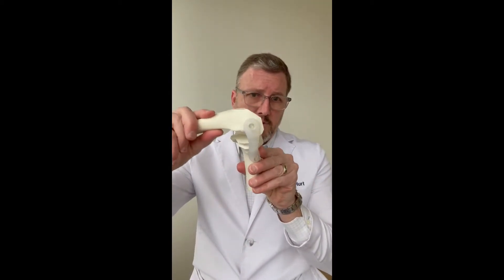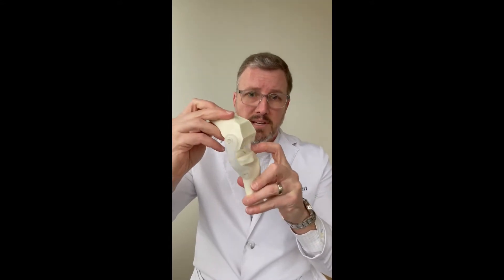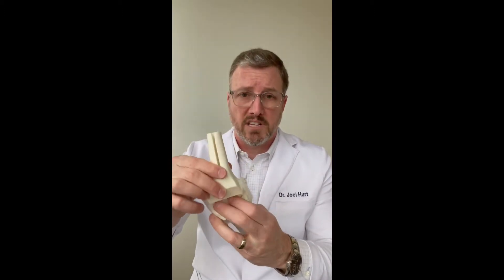On the femoral side, you've got these angles — you can see them right there. On the tibia side, the same thing: you've got one flat cut. And this is what we're creating before we put the knee replacement in.